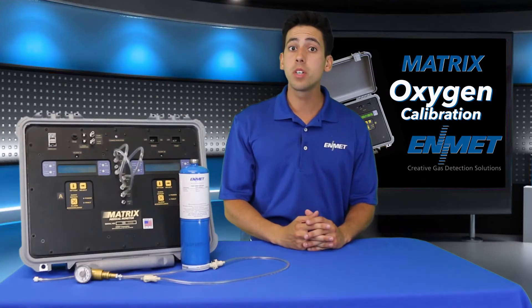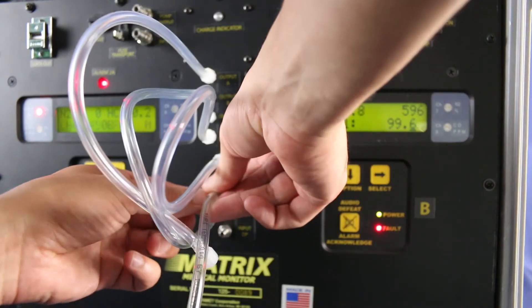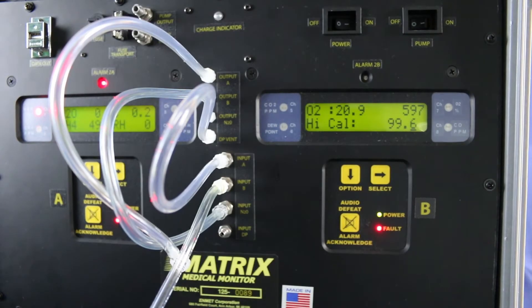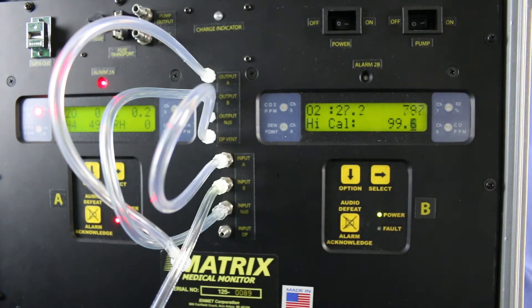At this time, connect the 20.9% or the 99.6% by volume oxygen to the matrix input B. Open the valve and begin applying your oxygen calibration gas, and allow the gas to flow to the sensor for about two minutes. Observe the millivolt reading in the upper right corner of the display for stability.